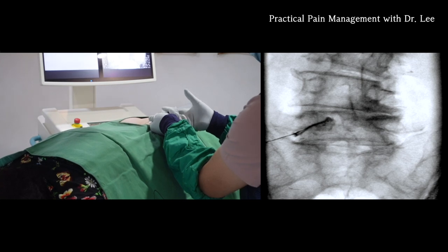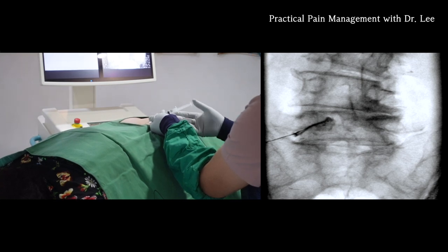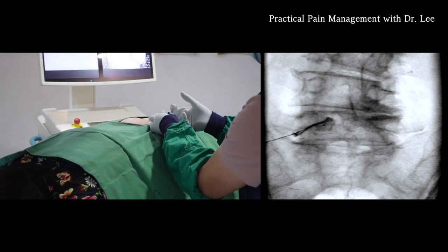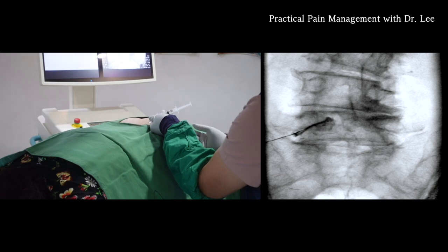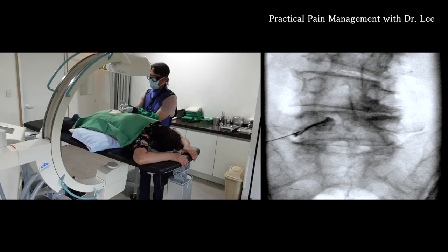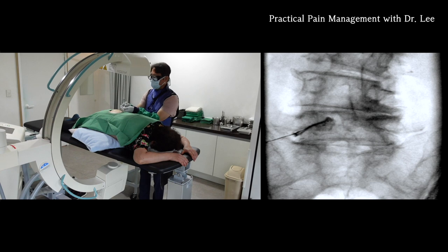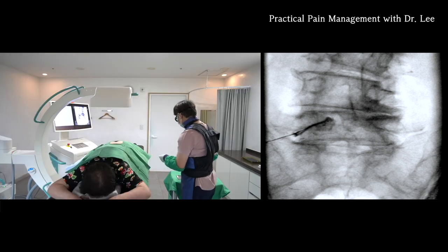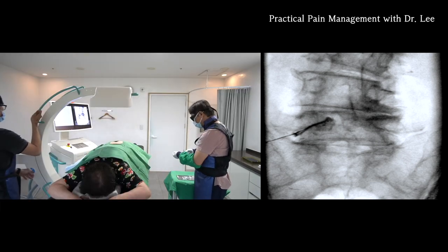She is expressing pain. Do not ignore the patient's reaction, so I must slow down the injection speed. If the contrast pattern is good, I don't need to relocate the needle. Otherwise, think twice.